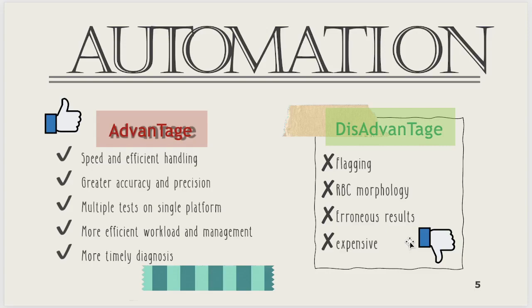When I'm talking about expensive, literally we are talking about millions. Natatawa nga kami sa sobrang liit na mga different machine namin sa hematology, no? It will cost us 1 million, 2 million, 3 million. Usually sa mga laboratory guys, meron tayong mga medical representatives and usually they will be the one that will somehow endorse their machines. Tapos, however, since most of the laboratory kasi, we are not actually buying the machine. We are actually buying the reagents.